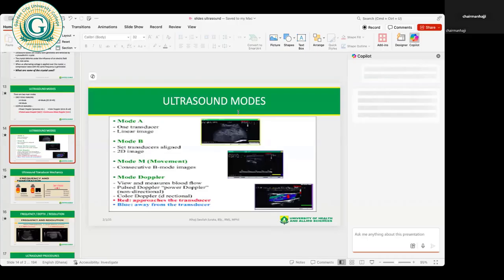These are images that would depict some of the modalities. In this image, you are seeing color Doppler. Okay, so over here you are seeing blue and red and green structures. Okay, and here you have another image of the pulsed wave, and here is a 2D image of ultrasound, which makes it a brightness mode.